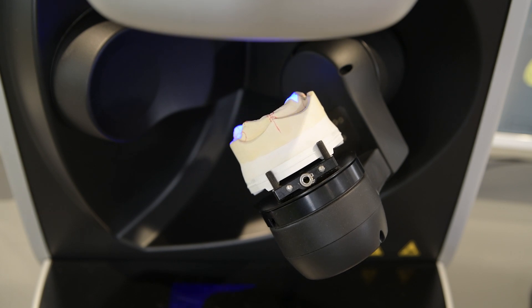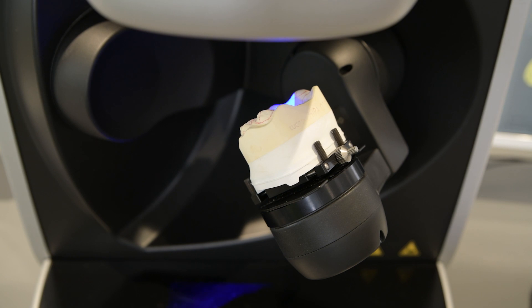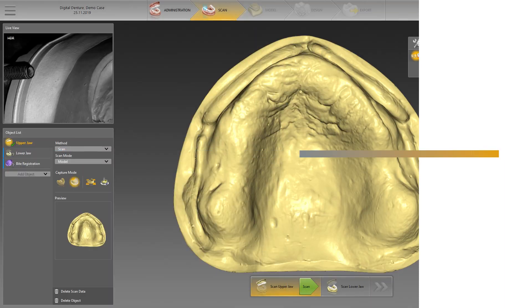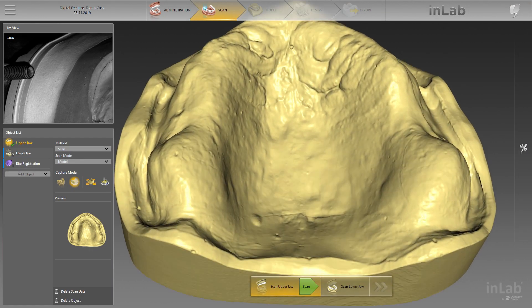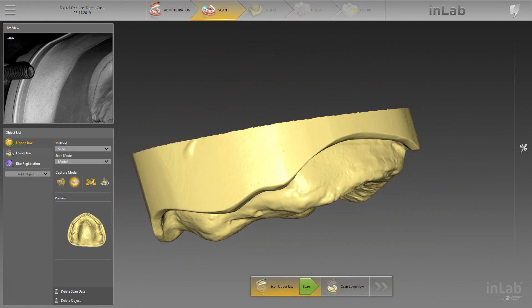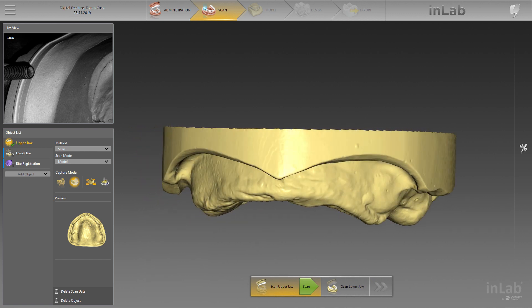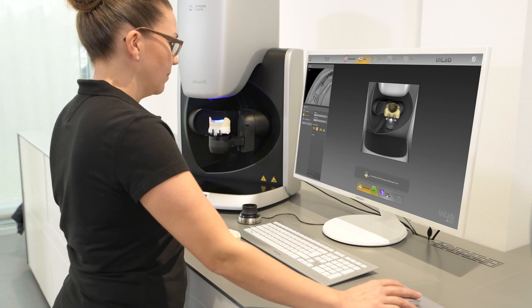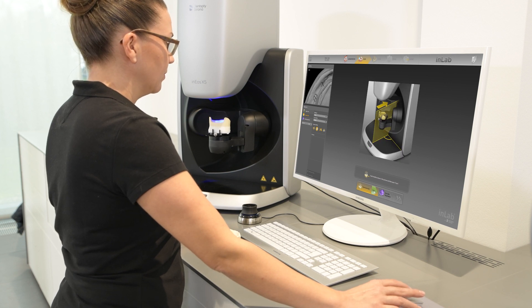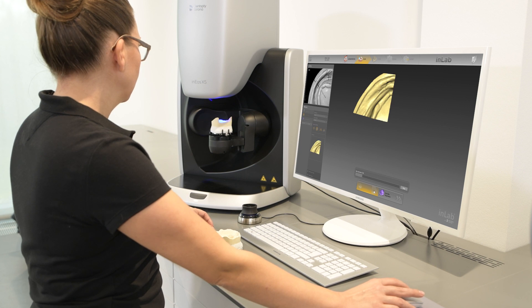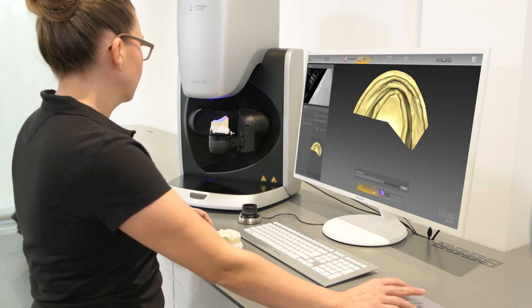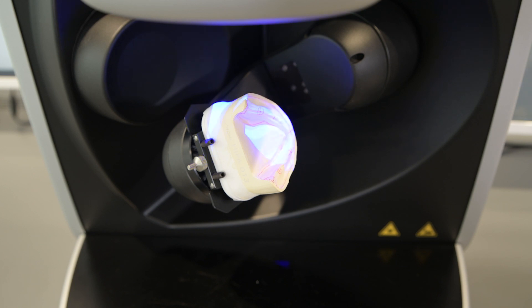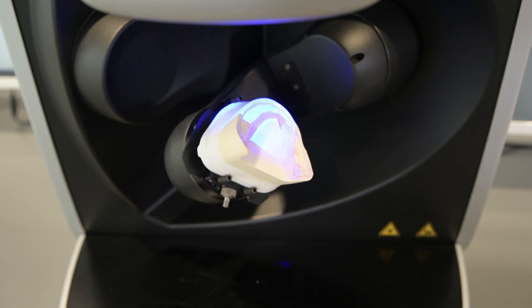The unique 5-axis scan technology of INEOS X5 makes it ideally suited for capturing all areas. Check the result, close gaps where necessary via double-click capture, or edit the model with available tools so that you have an optimal base for the later denture design. Let the step menu guide you through the recommended scan workflow and then continue with the scan of the lower jaw. If help lines were drawn on the stone model, these will also be captured and can be later displayed using the Show Marks feature in the Analysis tool.